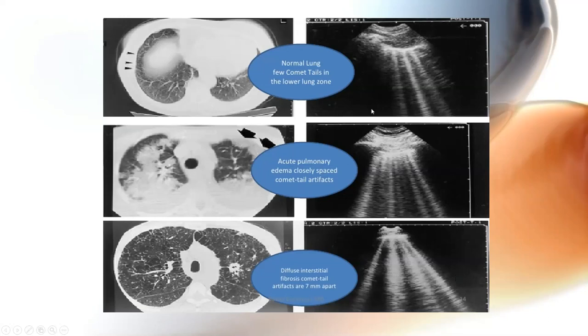And these are all ultrasound images of these people's chests with their corresponding lung CTs. The black arrows are showing you where the probe was when they got that image. So here and here, actually can't see where, because this is so diffuse, it wouldn't have mattered where you scanned on the chest, but you're going to see something like that. You put a stethoscope on one of these people's lungs and they may all sound the same. Crackles, crackles, crackles. So your ears can deceive you and your image might deceive you on what might be going on. And we'll put this all together when we start to apply what you're learning. We're still talking about artifacts at this point, but hopefully it's very clear what the differences between an A line and a B line are.